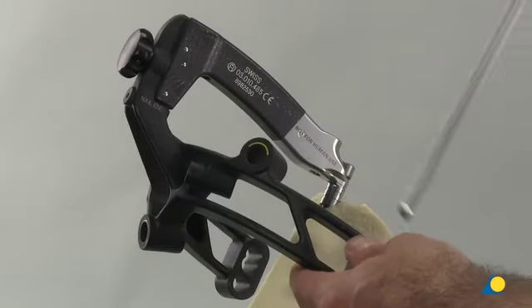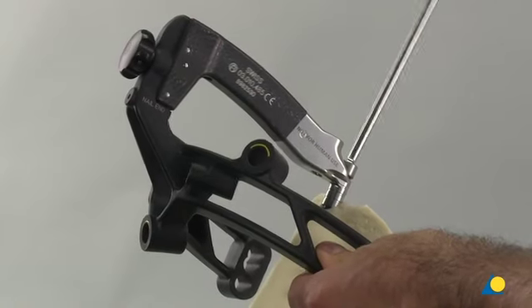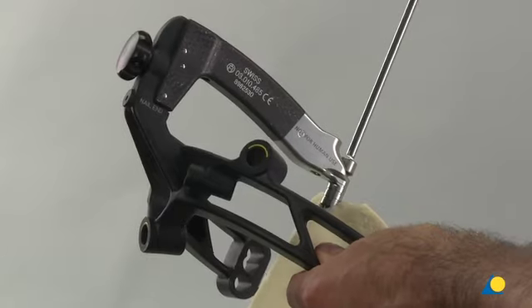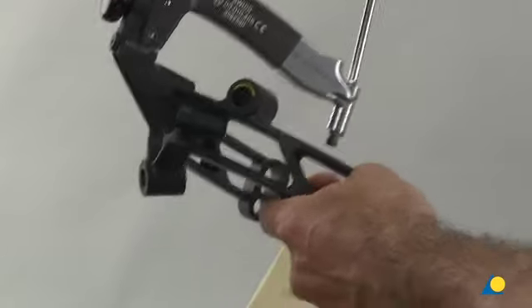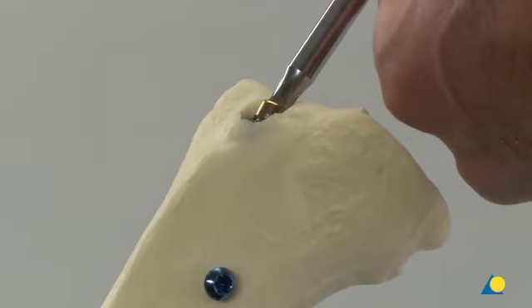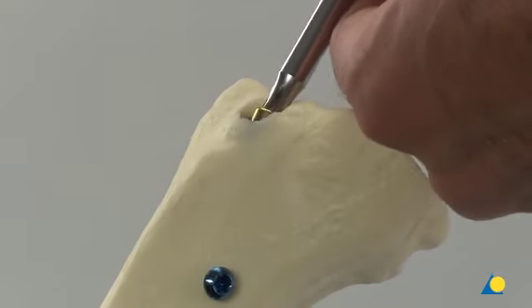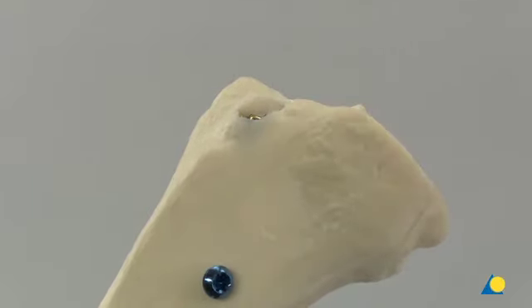The screwdriver, hexagonal 8.0 mm diameter with spherical head and T-handle, is used to loosen the connecting screw so that it can be removed together with the insertion handle and the aiming arm. To prevent cross-threading, the end cap is inserted in line with the nail axis. A counterclockwise turn can be used to thread it in the nail before clockwise turns are used to advance it and secure it.